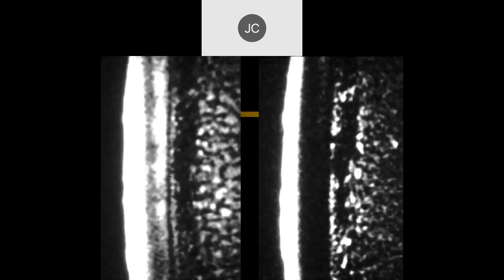This is a proton density image here. This is the image acquired at the same time, but with T2 weighting using the old double echo technique, which we no longer use. You can see the normal undulation of the surface. So with MR, if we actually had good signal to noise and do high resolution imaging, you can actually see the normal undulation of the articular cartilage. On the proton density image, we can see that there's difference in signal here, with more inhomogeneous and the deeper layers. On this traditional T2 weighted image, you can see the surface has a much higher water content and is very bright. The deeper surfaces is lower in signal intensity. It's lower in signal intensity here, primarily because of the dephasing due to the random orientation of the collagen fibers and the deep part of the articular cartilage. And then here, this is the calcified layer here. And then we can see the trabecular bone deep to that.